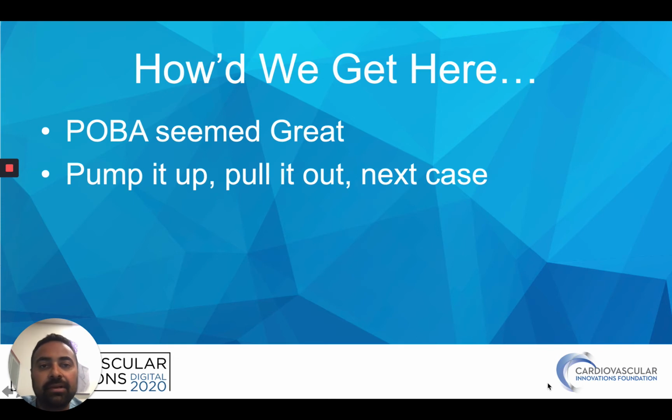How do we get here? So plain balloon angioplasty, POBA, seemed like a great idea a long time ago when we started endovascular interventions, and actually for some people still seems like a good idea, even though I think we know better that just POBA alone for a lot of heavy disease is not significant. Pump it up, pull it out, next case. It's an easy way, but I think we know that TLR and all those get affected significantly by just POBA alone.